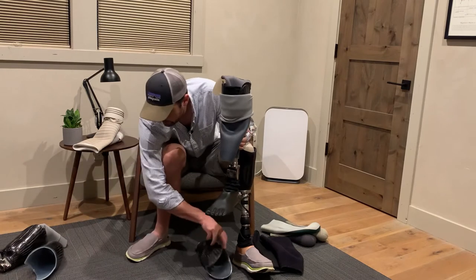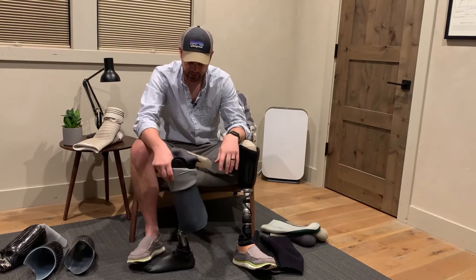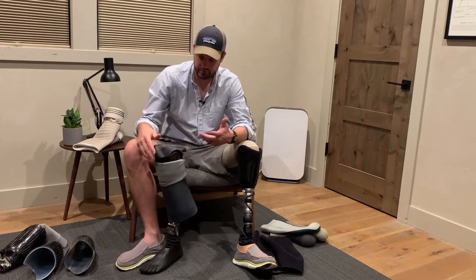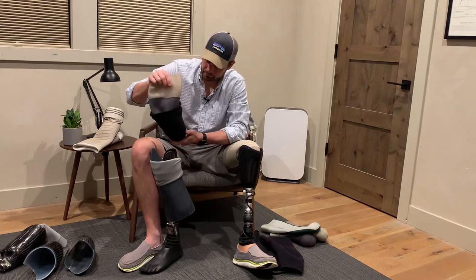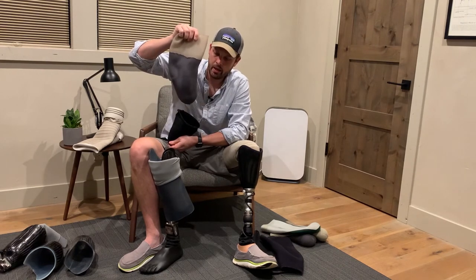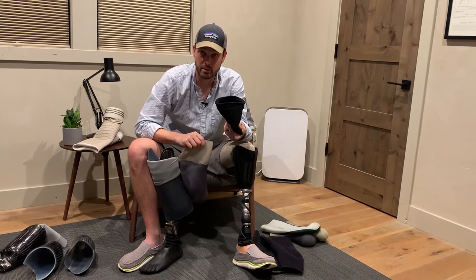This is kind of the whole package here. This is now my more durable leg that I'm not worried about getting beat up because it's built like a tank — it's just a solid leg. You've got your liner, and over the course of a day your leg size changes, and that's where socks come in.